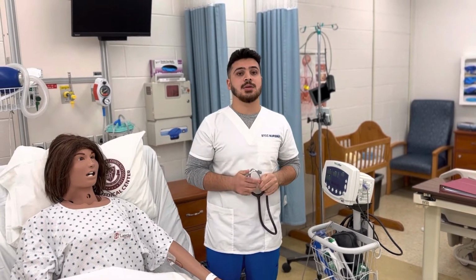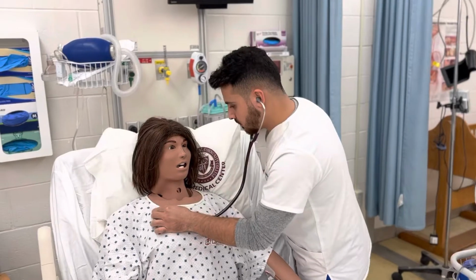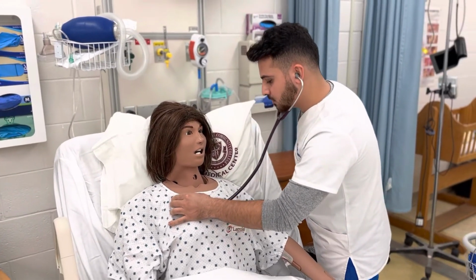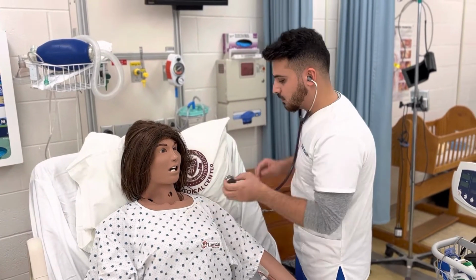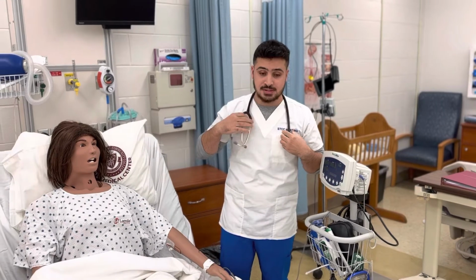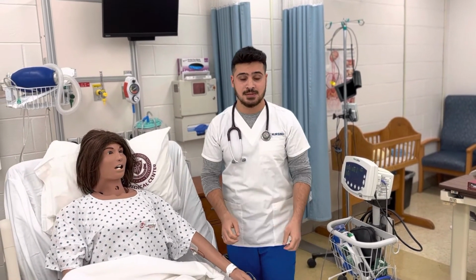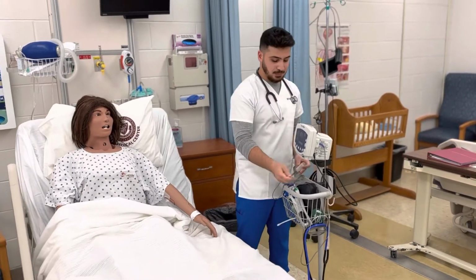Now we're going to listen to the patient's lung sounds. Assessing the patient's lung sounds and oxygen saturation will help us determine the effectiveness of the medications. Now we're going to move to the third part, which is implementation.